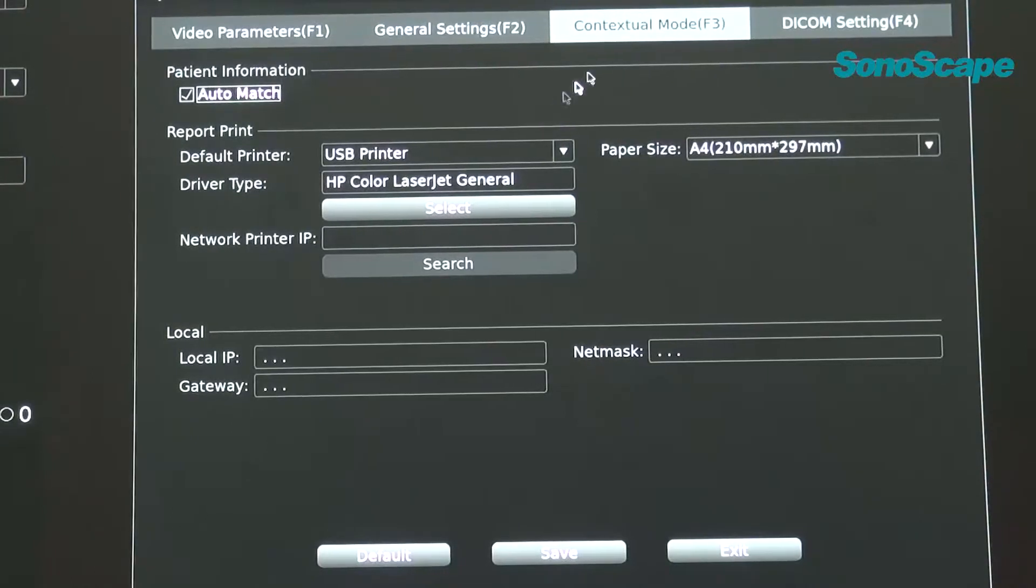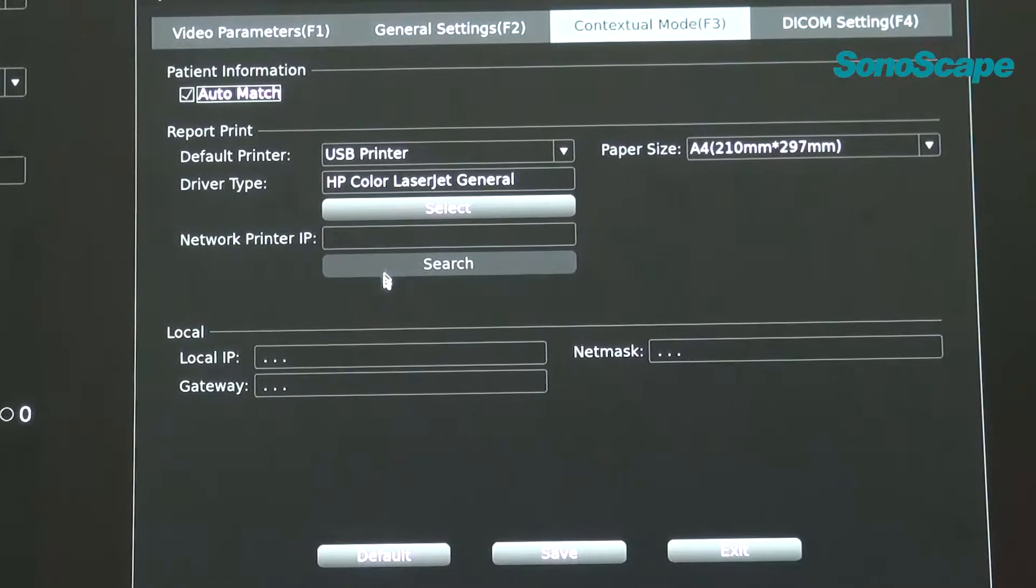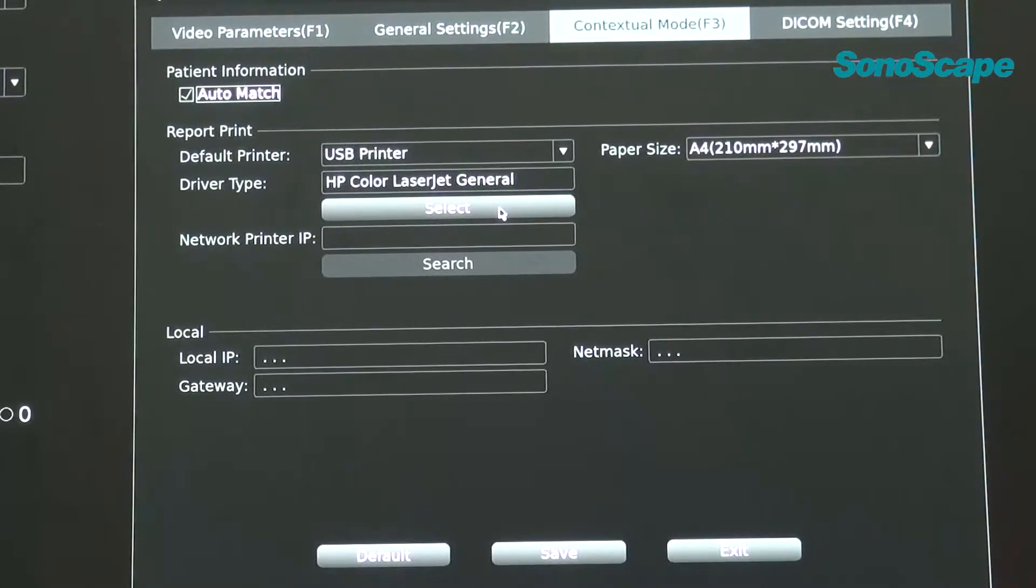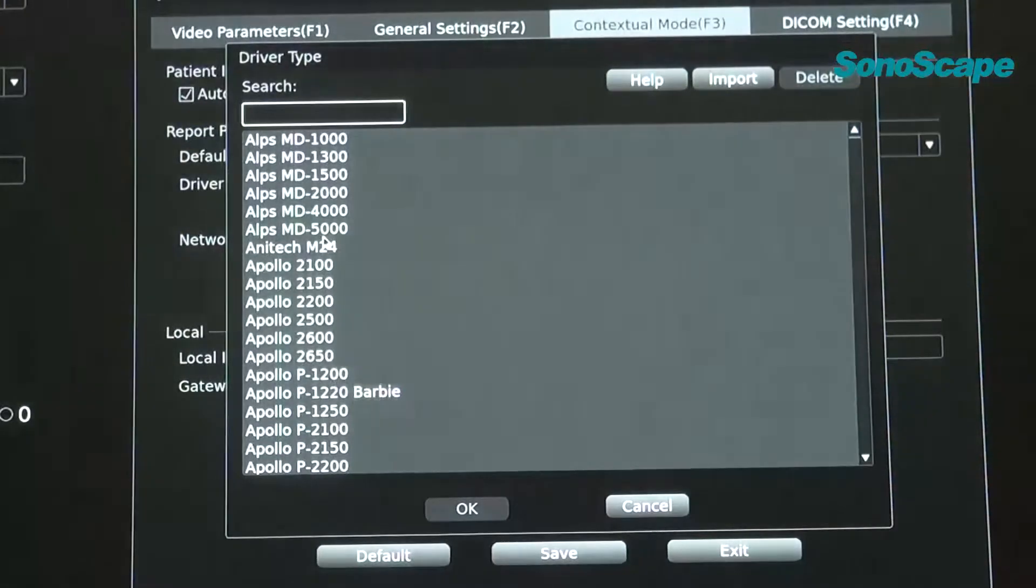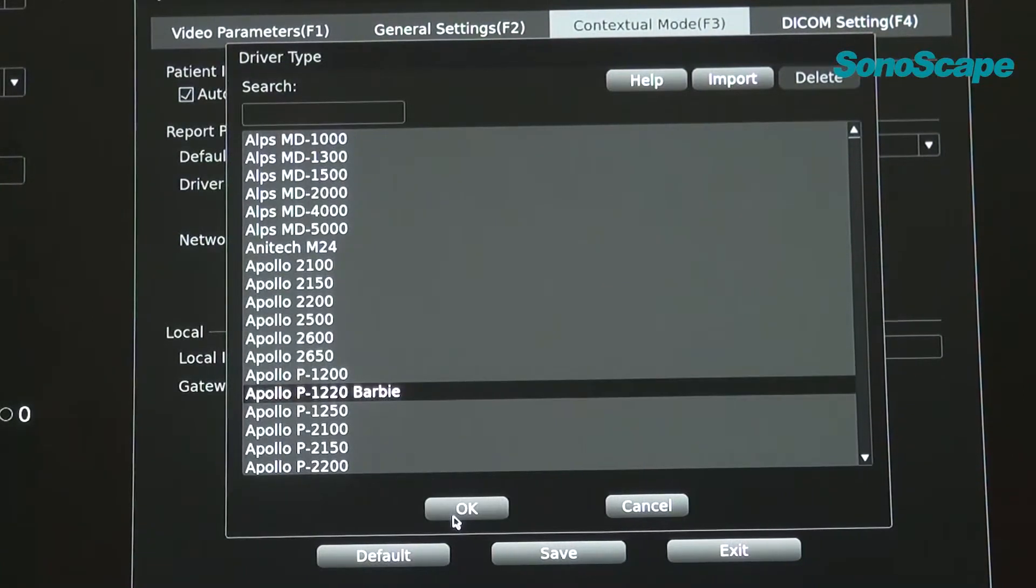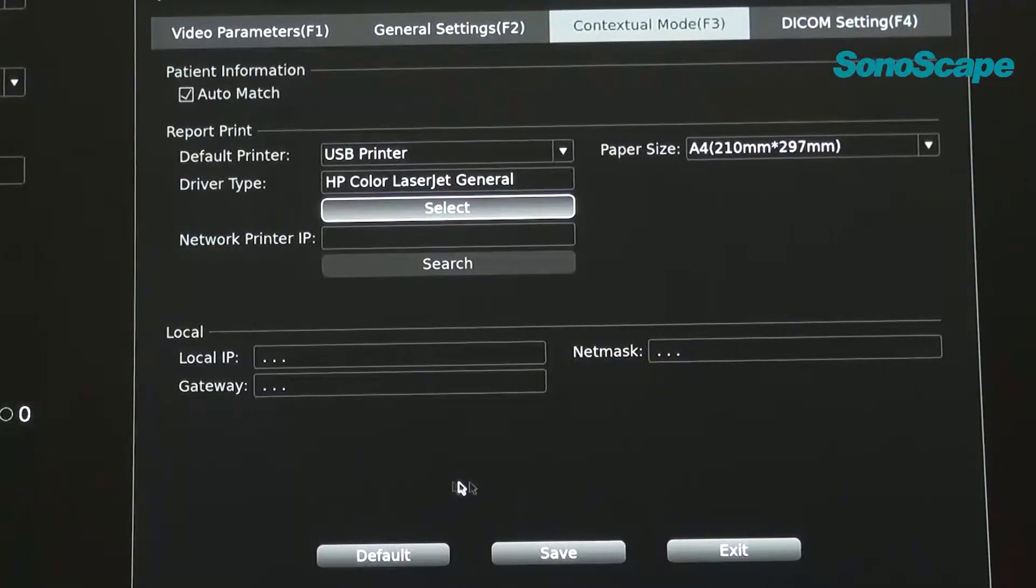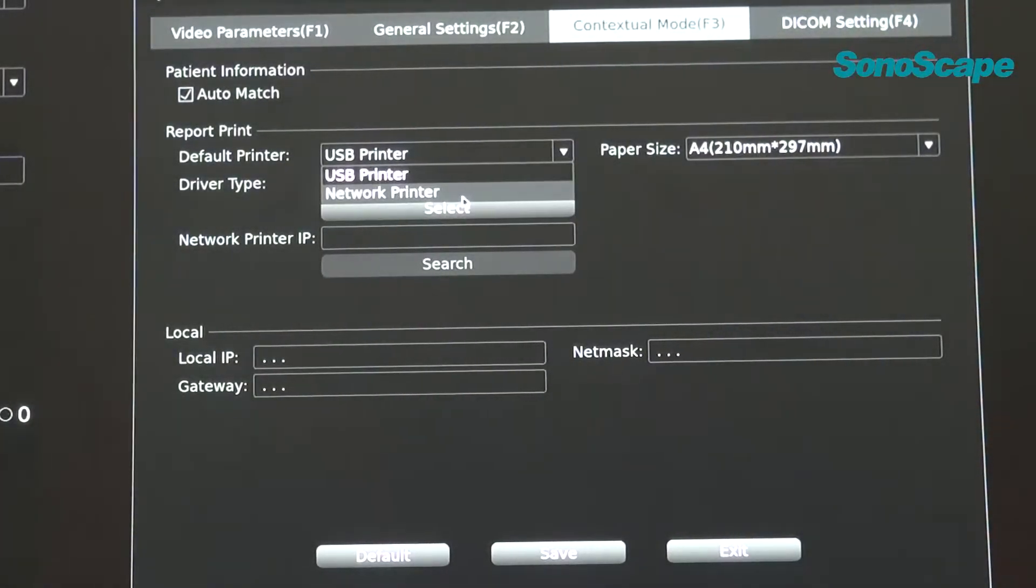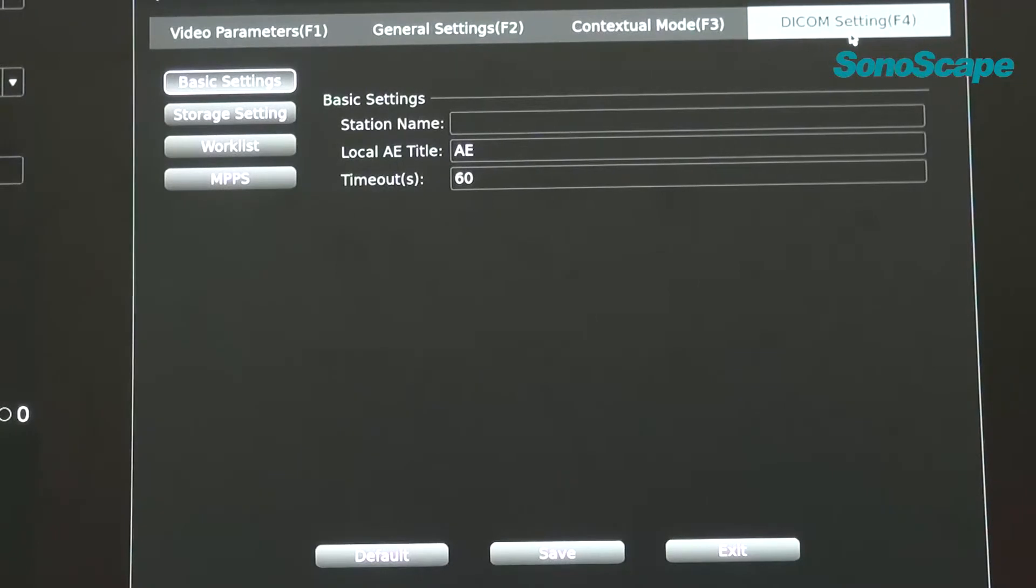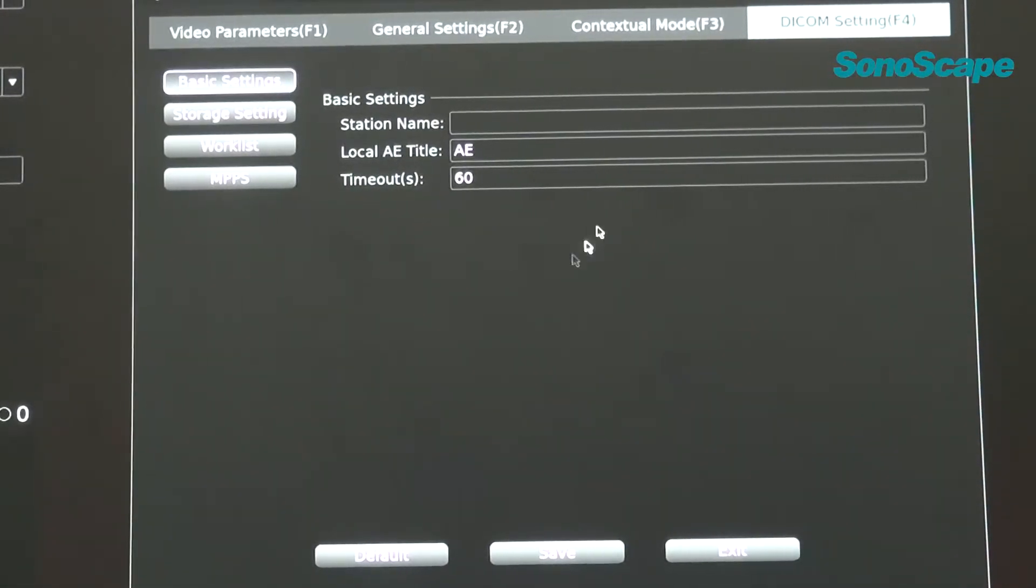F3, contextual mode. This page is mainly for the setting for report printer. The default printer is USB printer. When you find the right model of the printer, you can select here. It is a preset driver for the printer. You can select one of them and then press OK. Click OK to save the settings. And also, if you choose network printer, you have to deal with these IP settings.